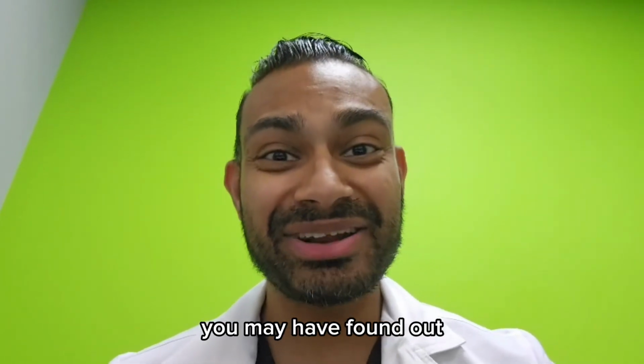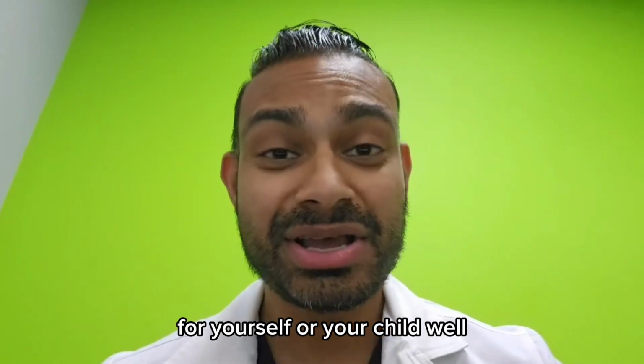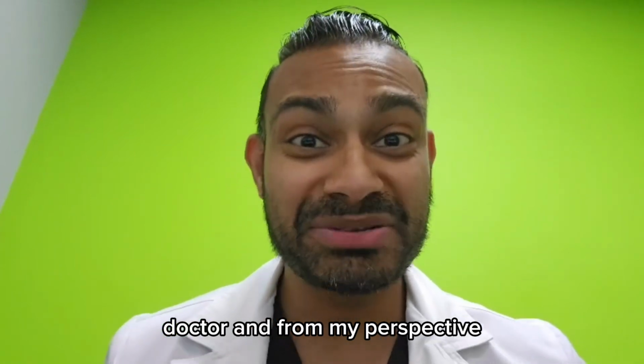So, you may have found out that you're a candidate for orthokeratology for yourself or your child. Well, what can you expect at your next visit? This video will go over what you can see at the eye doctor, and from my perspective, what we want to collect.